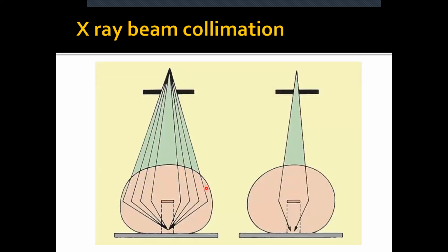All right. And so here's a different concept, which is basically when we want to release radiation into the patient's body, we don't want all of this extra radiation to be everywhere because that's going to cause a lot of noise.